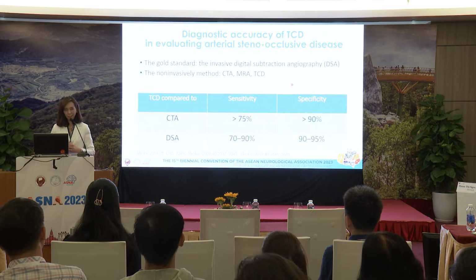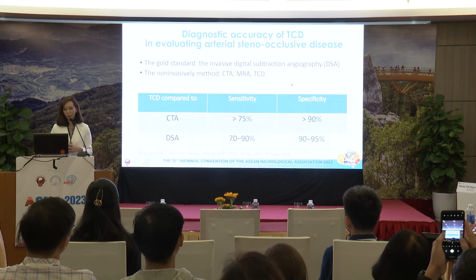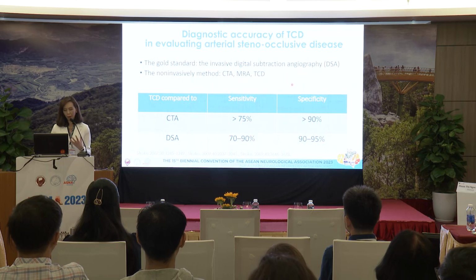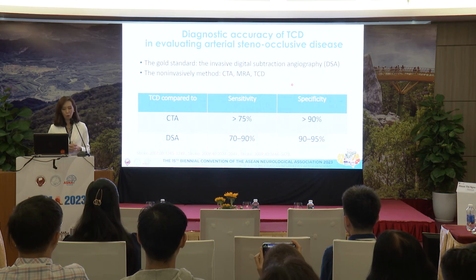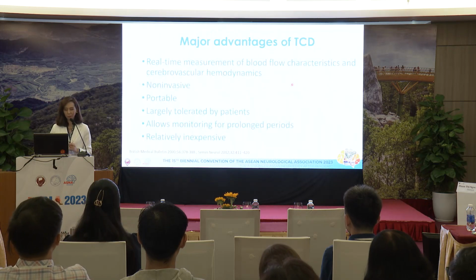And it has been tested in many studies that TCD is very good at picking up the stenosis of the blood vessel in the brain. So these are some examples of the sensitivity and specificity of TCD compared to CTA and DSA. And it's actually, I would say, quite operator dependent.